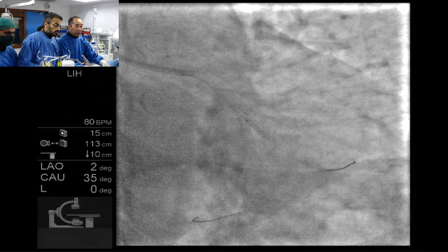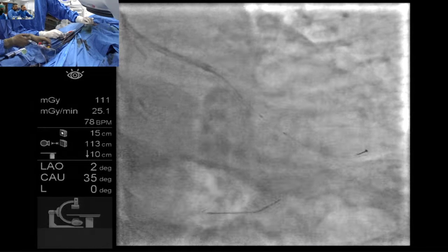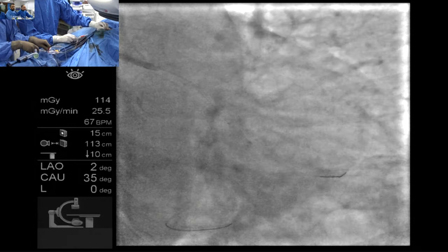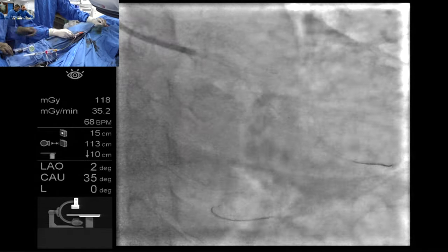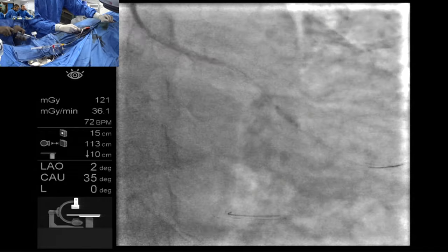I'd like to ask the panel, when we decide to have a two-stent strategy instead of provisional stenting, what kind of criteria do you use? Size of the branches, severity of the lesion, and the amount of myocardium subtended by the branch. The main vessel is obviously assumed to have a large amount of myocardium. Anybody else on the panel? Any other criteria? I would like to hear from Dr. Colette or Dr. Samir Pancholi.